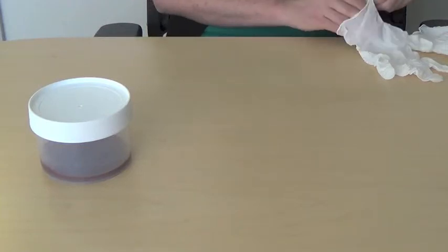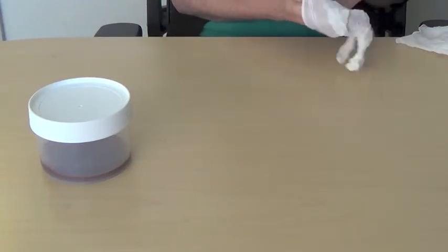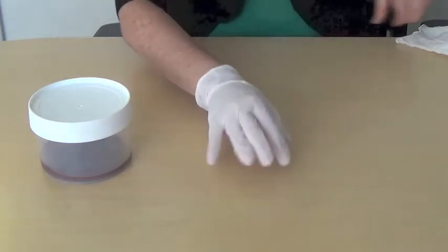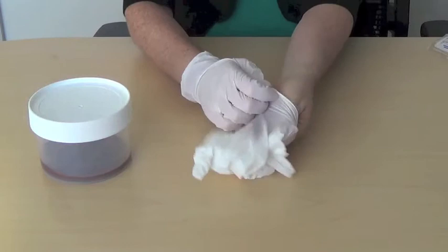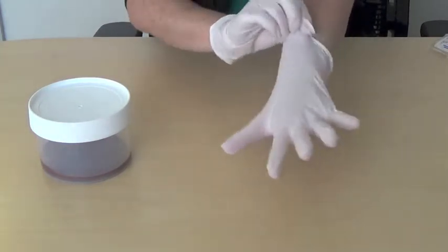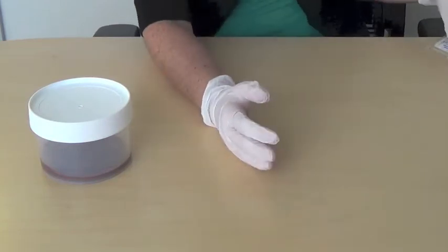First, I'll put on my gloves. We'll start with an Amy's tube.